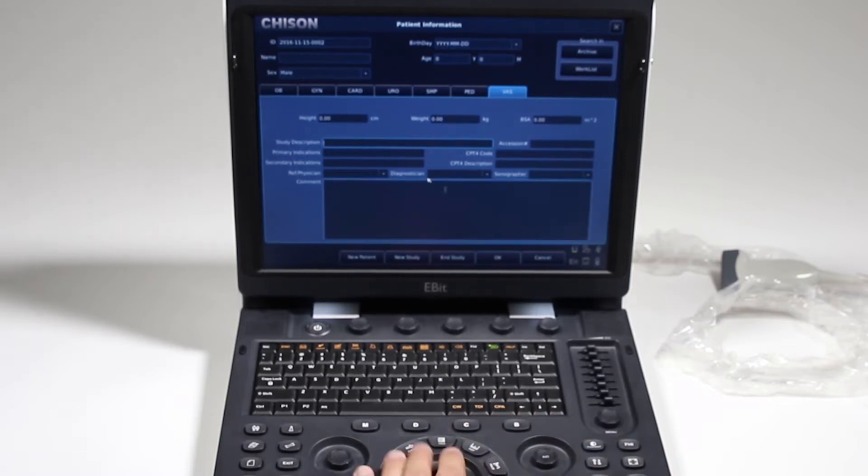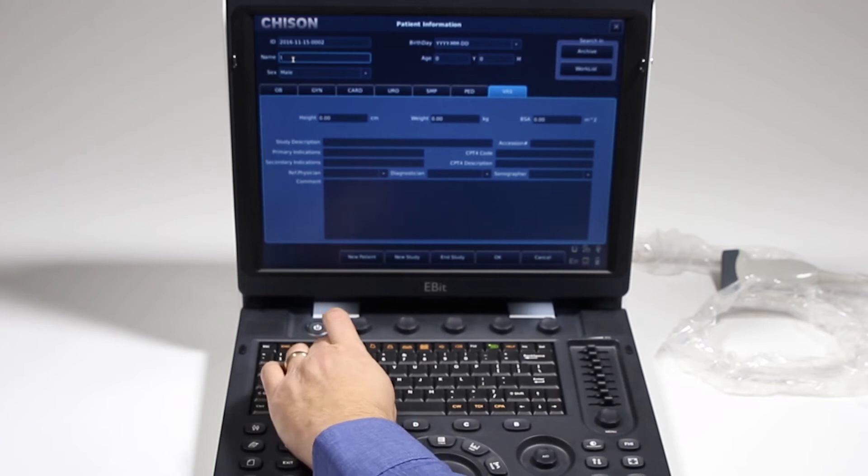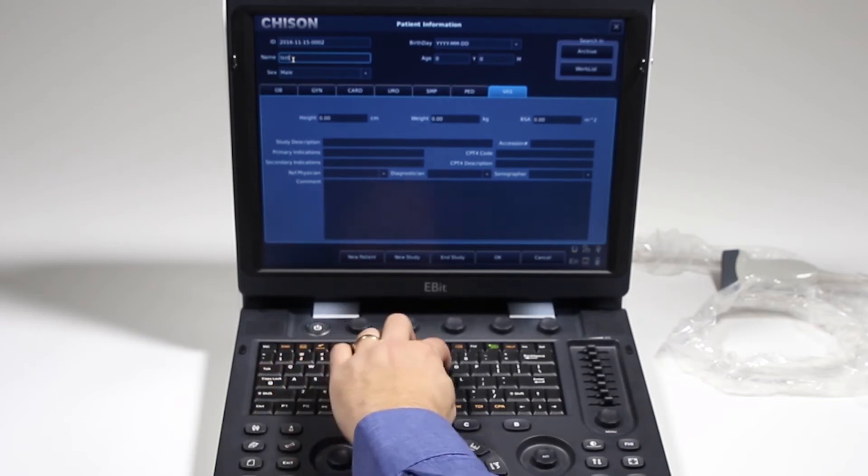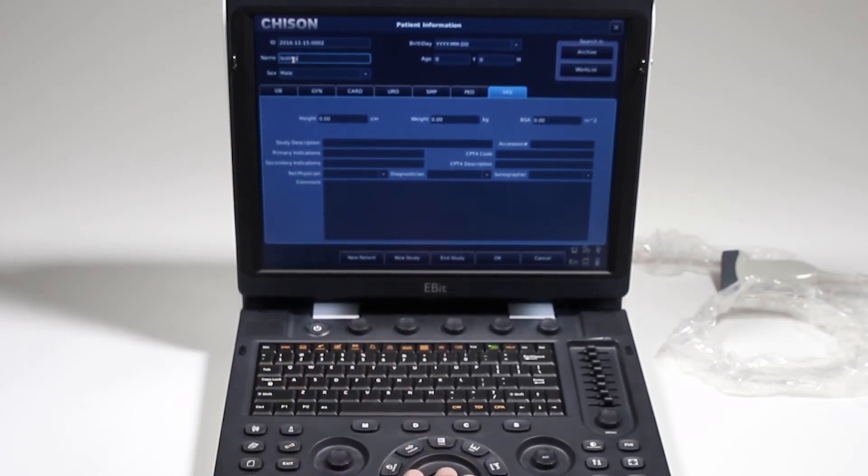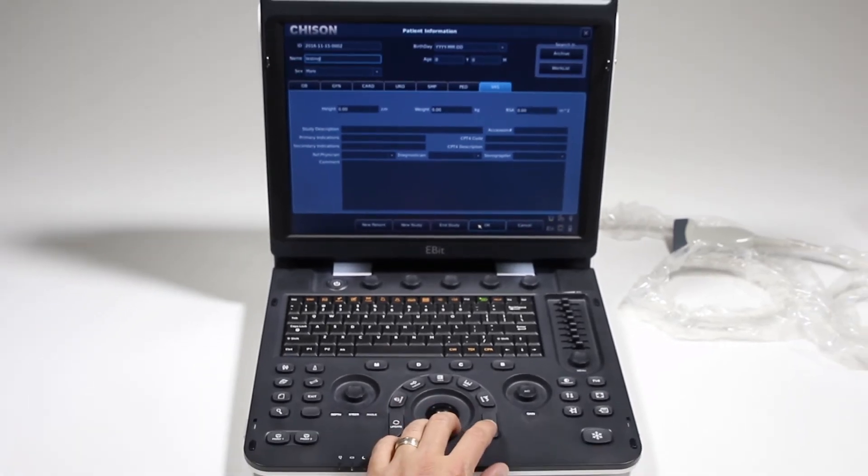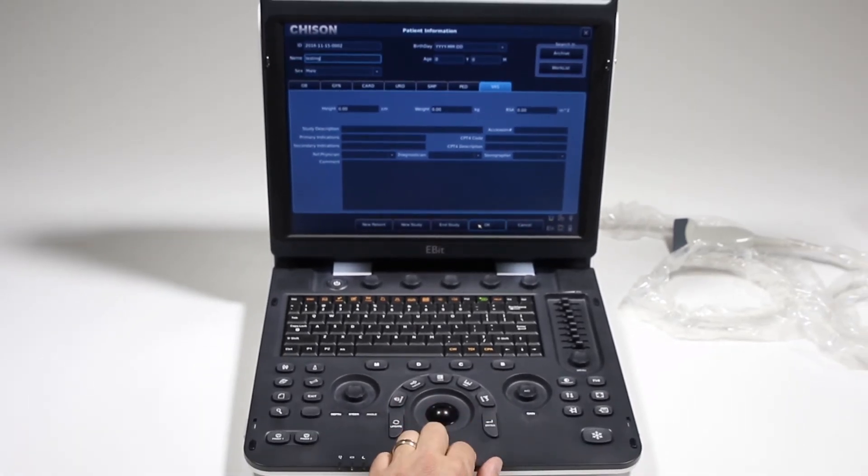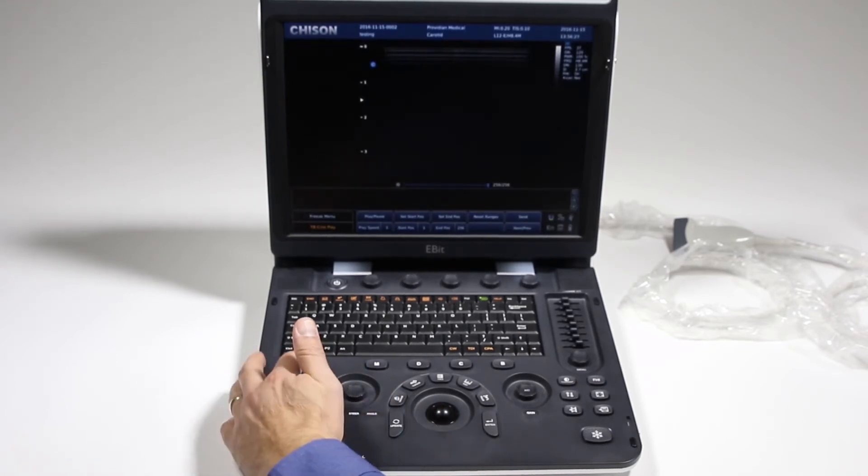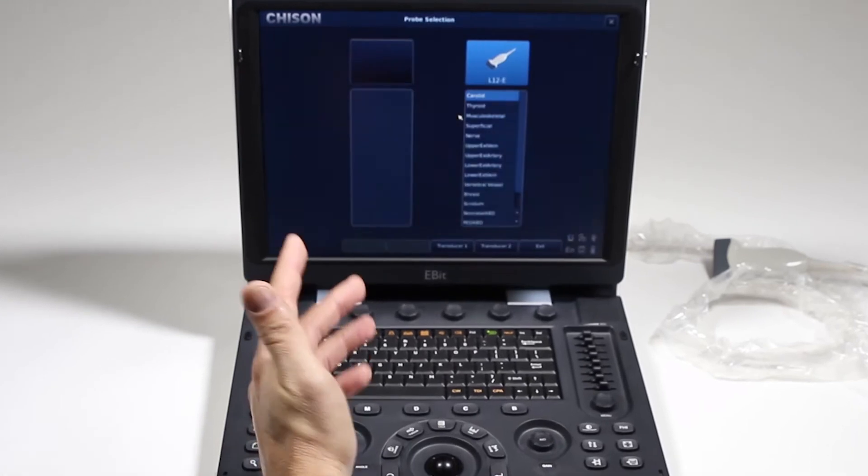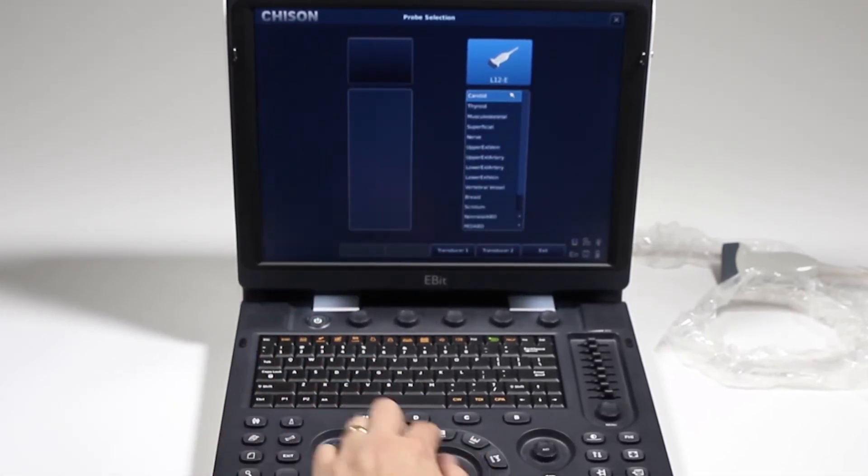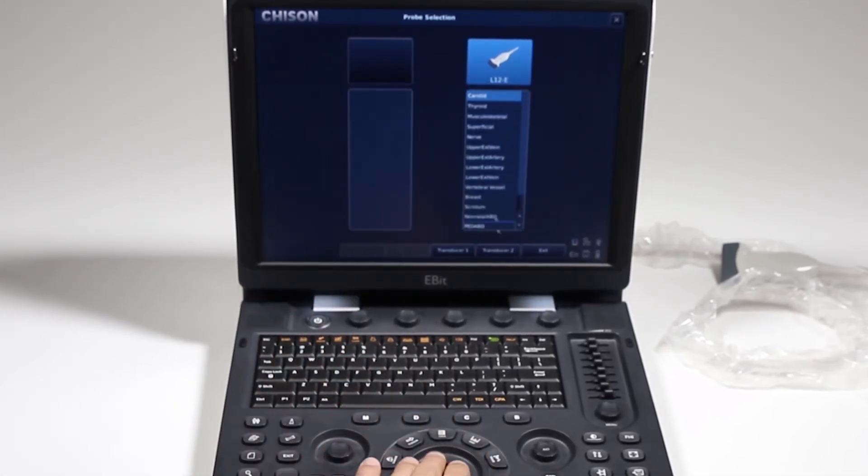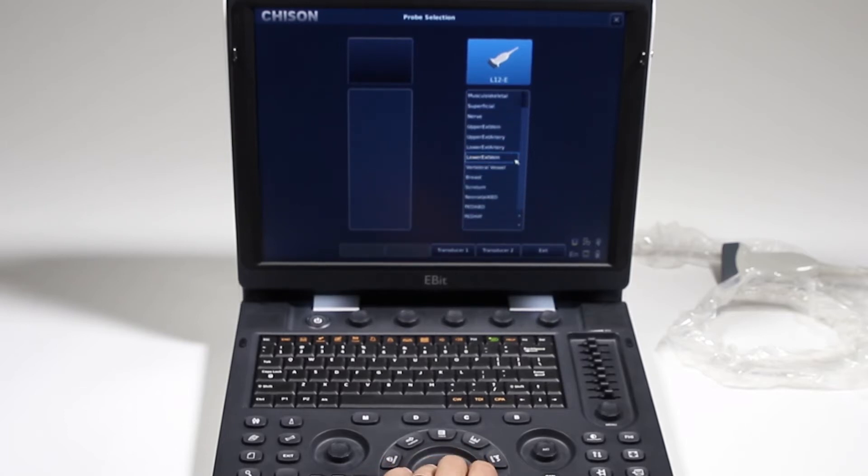When you enter all the information, I'll just type in testing. You can go ahead without a patient name, although obviously you would want to do that. We'll click OK and we're ready to scan. It goes to the default setting, which is carotid on this machine. I can select from here by pressing that probe button, the various presets that are there. If I want to scroll down to see everything available, I can go here.